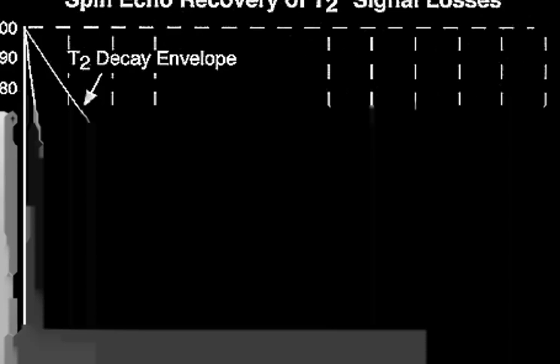That doesn't change. Now, the time varying would be if you have two water molecules near each other, but they're moving a lot while we're taking the experiment. Each of them is a magnet. Each of them changes the local magnetic field where they are, and therefore the exact magnetic field at one proton is going to vary over time because it's next to a proton from another water molecule that's moving in and out, and therefore varying the magnetic field. That's why it's called spin-spin interaction.